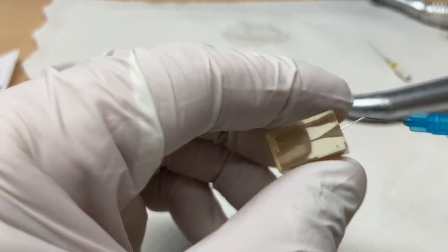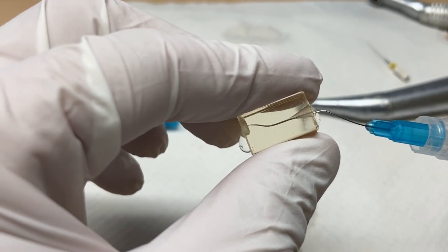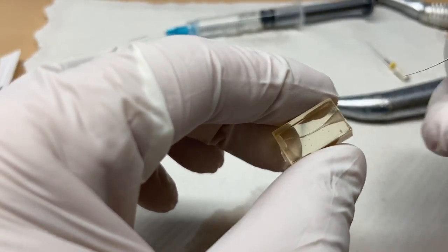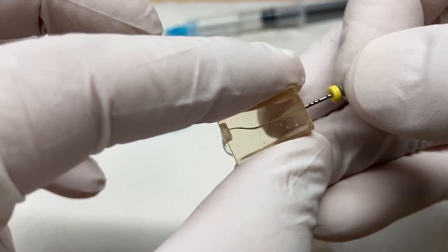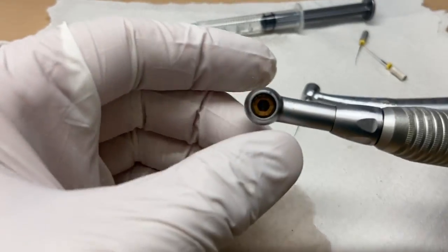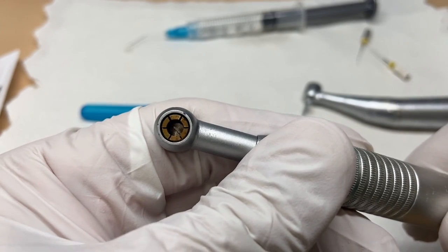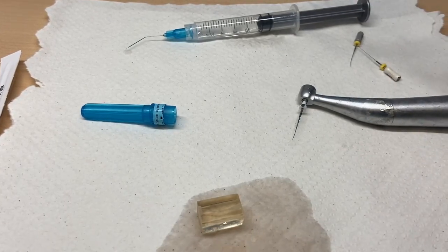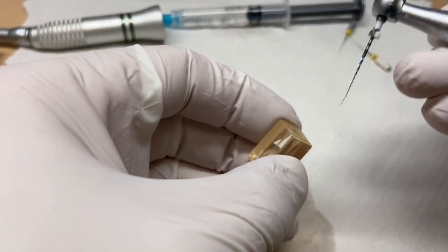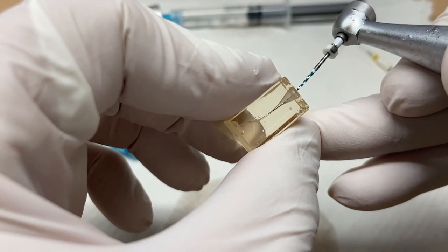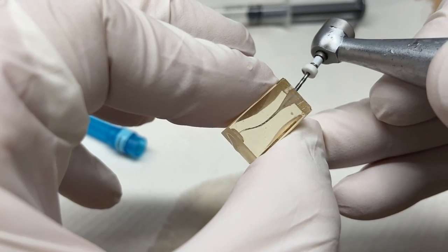Okay. So what we'll do there then is we'll irrigate this. Now, if you take my course, we're going to talk about a different technique about opening up canals, but just for using this block, because we usually open the coronal two thirds. There we go there, nice and smooth before we tackle with hand files, but this is just one way to do it. So after you do that, what you do is take your, this is actually Brassler glide path file. And we just run that down. This one should go pretty quick all the way down. Oh, and we're done. So then we'd have our glide path set already.